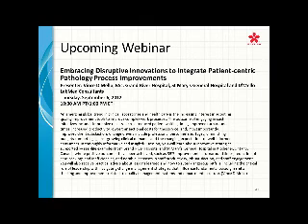Another question is, what is the recommended melting point of paraffin for processing? And, well, you can answer that and then I'll ask the second point of the question. Okay, generally your melting point should be between 60 and 62 degrees for your paraffin.